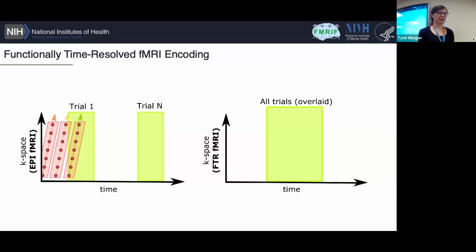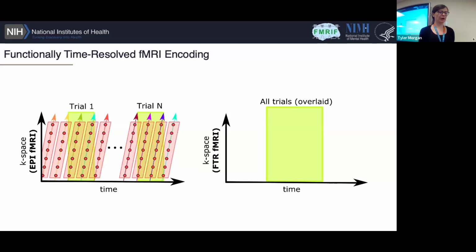And we're just going to repeat that over and over and over again until we end up with a time series. And then we also hopefully have a log file and some data from our Biopac and all of these things. And we can try to take care of these after you've already done the reconstruction. This is what we typically do when we do things like fMRI denoising and GLMs, etc. But you can also think about this during the reconstruction process, like I said.